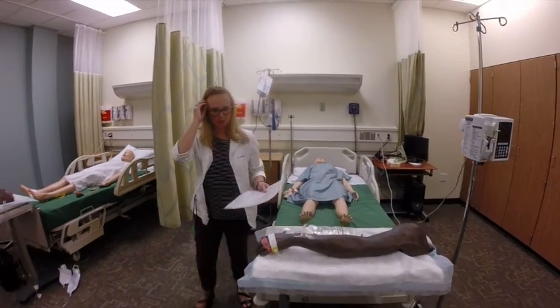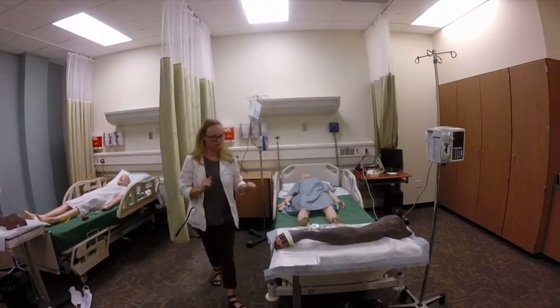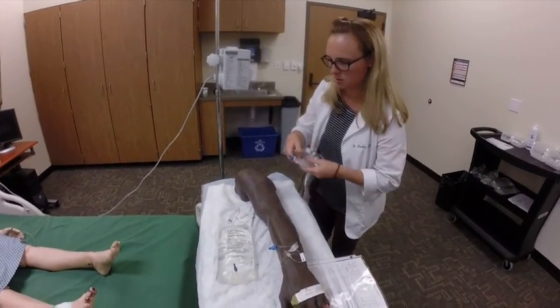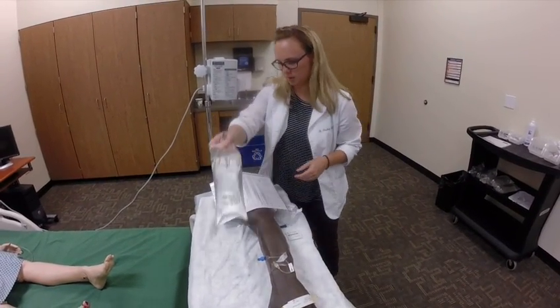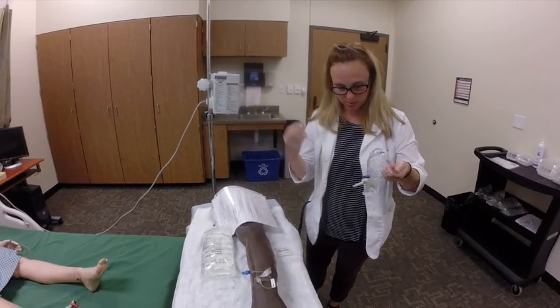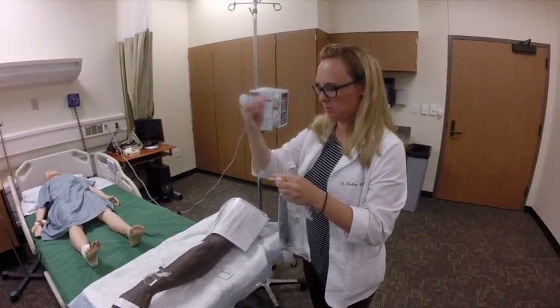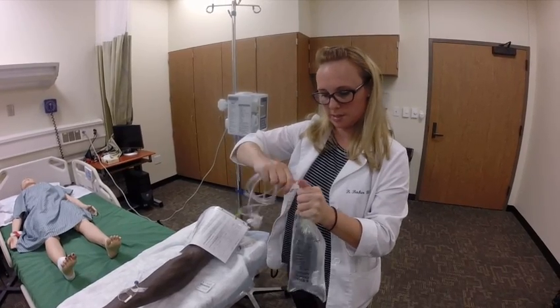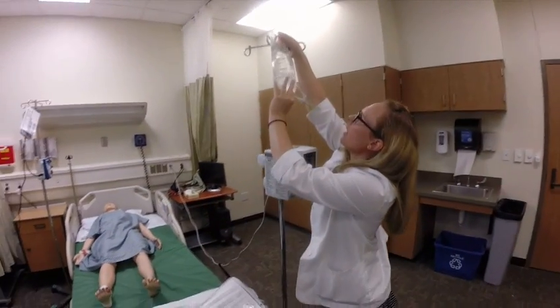So I'm just going to be hanging some normal saline — that's just to get you hydrated. It's really hot outside. I'm going to wear gloves for this. So most of my bags here in the lab have been opened, so you want to make sure you don't spill it. Remove your tabs — you can do this any way, this is just the way I do it. Remove the blue cap, remove the clear cap from my spike. Try not to touch either one — you don't want to contaminate it. Just screw that in there nice and tight and put my bag up.